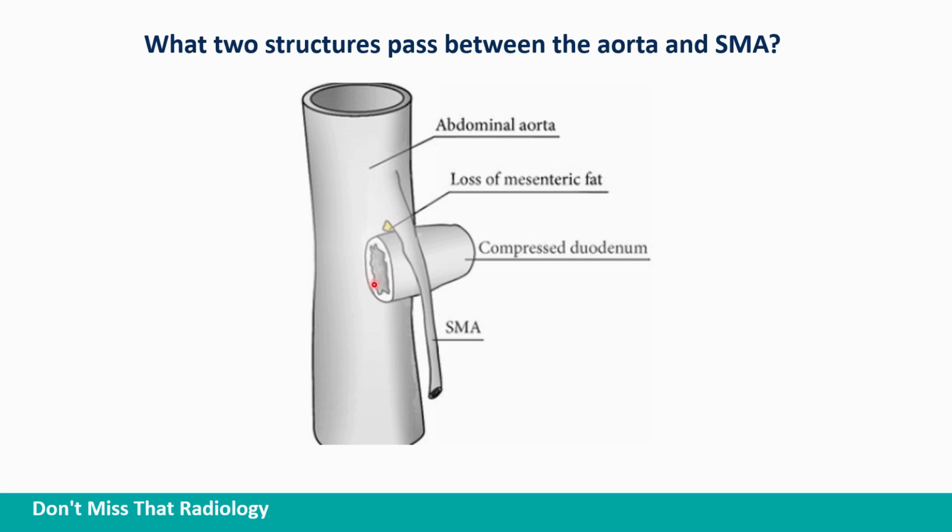So we also said that the left renal vein crosses. Well, we'll see a CT image coming up in a second, but be thinking in the back of your mind, what could the consequence of that be if the left renal vein is getting narrowed as it crosses that long distance?